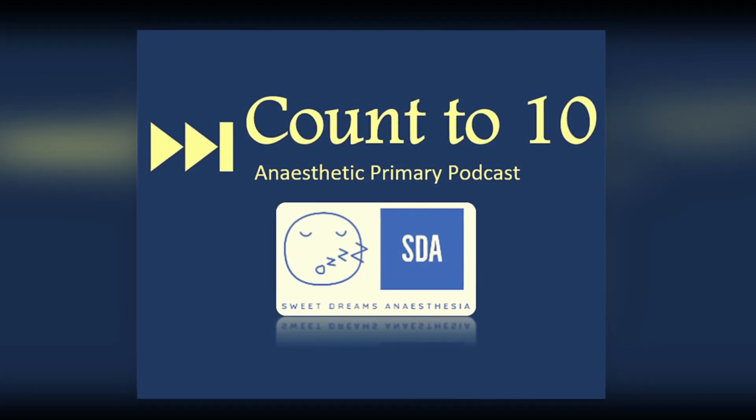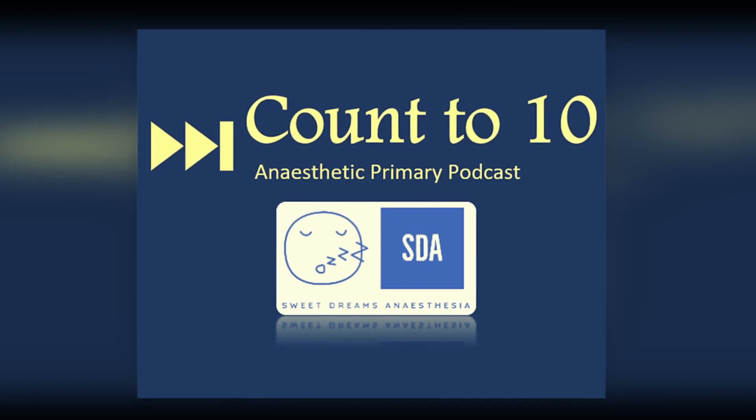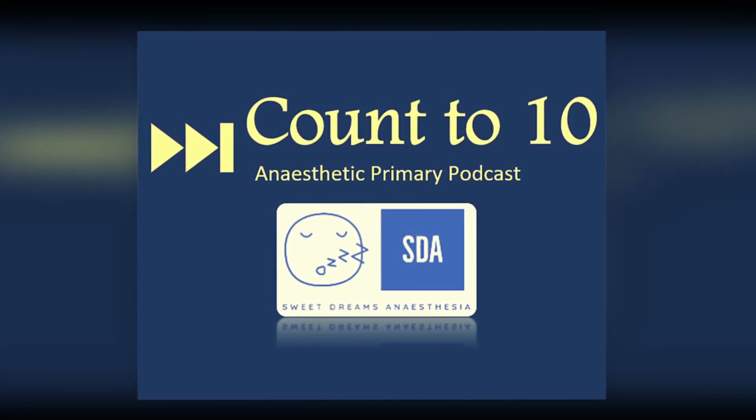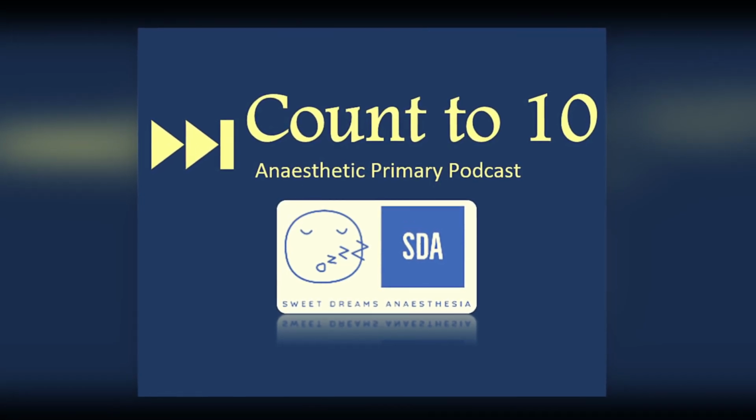This difference allows us to make an equation, which is called the ratio absorbance equation, or the R equation. And this R value, which is useless by itself but has been correlated with subjects breathing hypoxic mixtures, and then extrapolated to give us a curve, allows us to put a percentage to the R value.